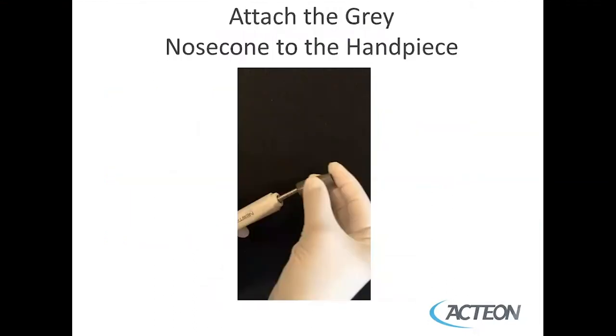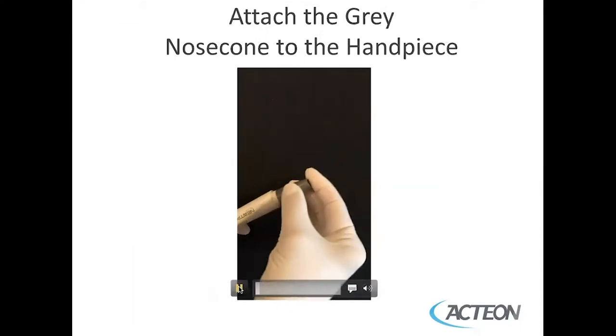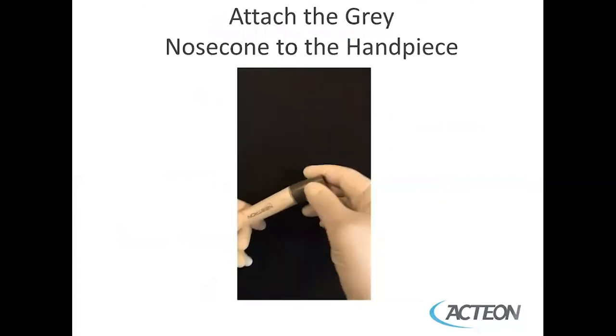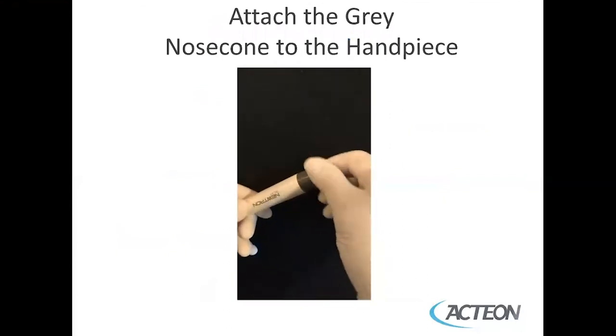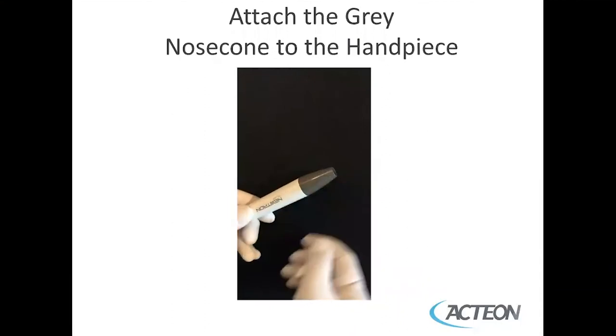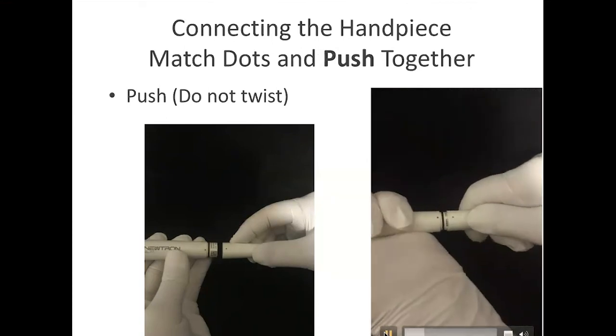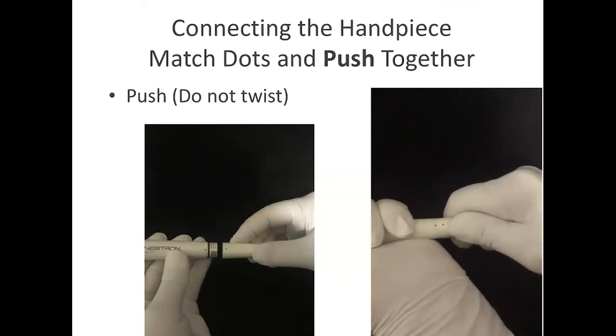When you receive your kit, you should make sure that the gray nose cone is attached. If it's not, simply put the gray nose cone on by screwing it onto the handpiece. The next step is to connect the handpiece to the cable. You'll see a dot on the handpiece and a dot on the cable — it's simply a matter of pushing the two dots together. You should not twist or turn it, just simply connect the dots.